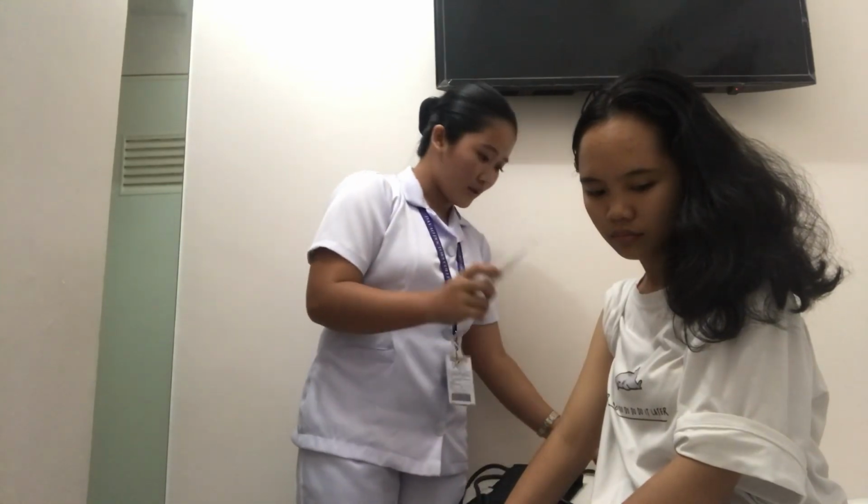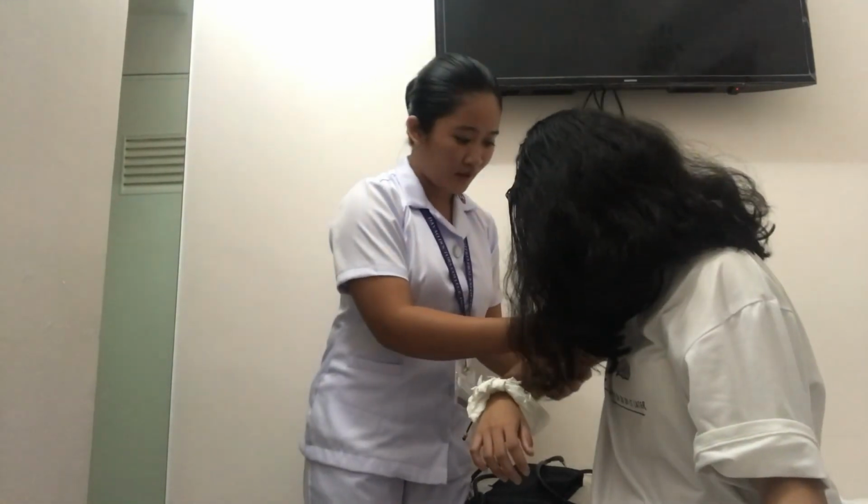Now I'm going to use a different thermometer for my patient's body temperature through her axillary site. Before I place the thermometer on her area, first I need to look to see if there are any scars or lesions and pat dry the area if it is wet or moist. Okay. So ma'am, please raise your hand for me. Thank you.